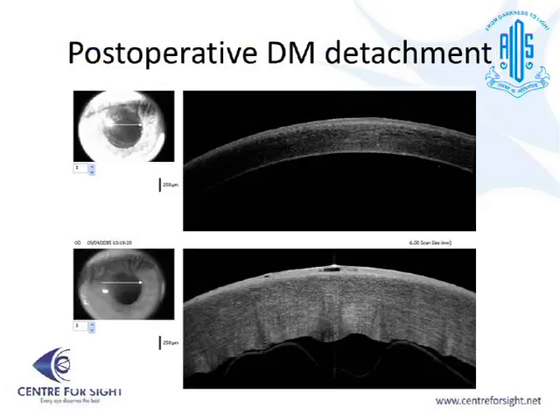Similarly, it's very useful in DM detachments in the post-operative period. Approximately 14% of the DM detachments are picked up on OCT in the post-operative period, as corneal edema does not allow us to visualize the DM detachments.